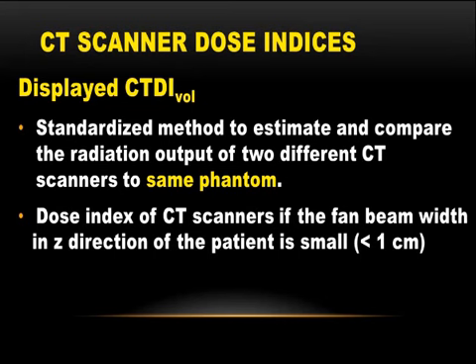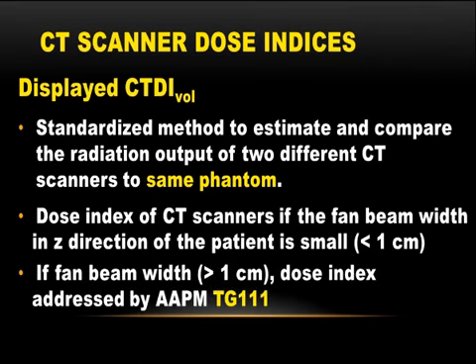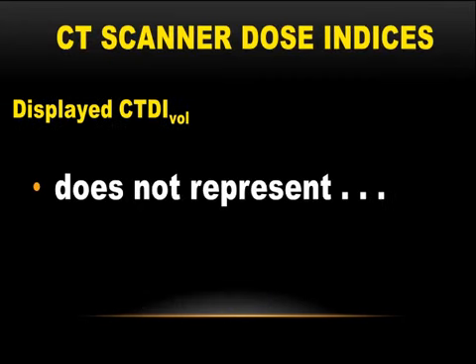We still underestimate, however, the dose with the CTDI, even at less than 1 centimeter. And as we get out to 40 millimeters and larger, we certainly do not capture all those tails, and the physicists in the room are all aware that that's what TG 111 really addressed, which was published by the AAPM recently.